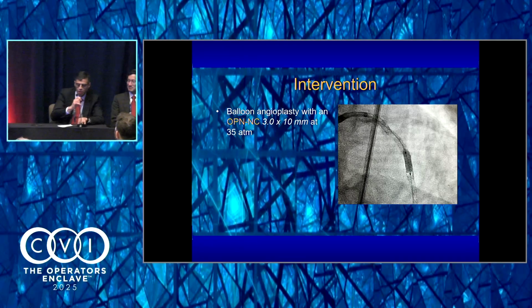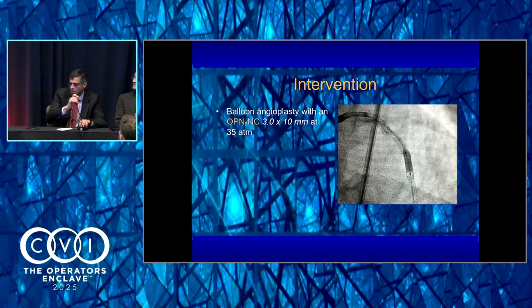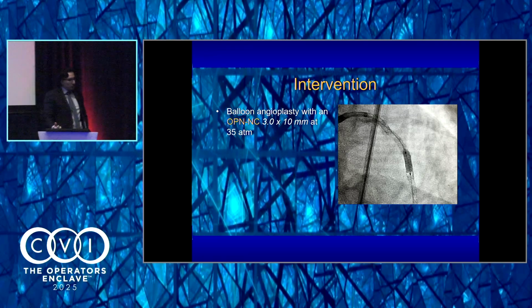The conversation was earlier on that there's concern about deliverability, right? And here you had some issues earlier on. Did you have difficulty delivering the balloon to the lesion? I had no difficulty at all. So after the laser and pre-dilating, I had no issues delivering this.